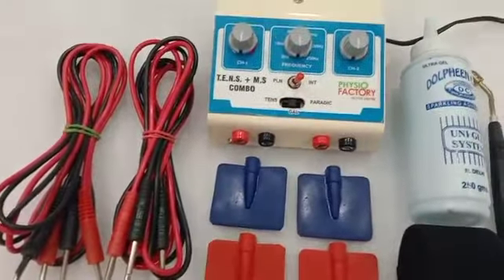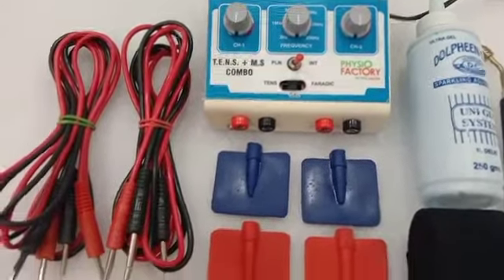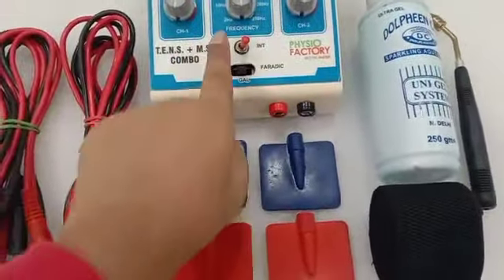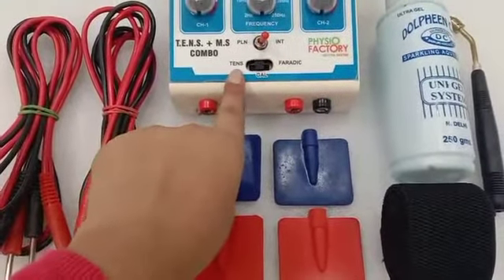You can carry it for home visits. It's about 1 kg. There are two channels — channel 1 and channel 2. This is the frequency area. There are two current modes: plain and intermittent.